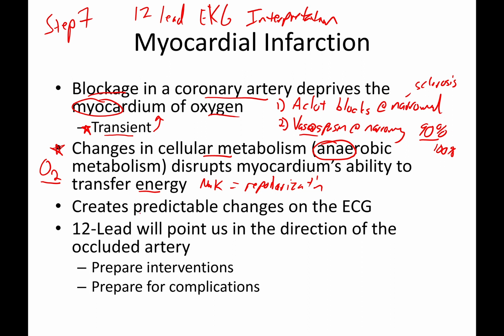Well, they look like predictable changes on the ECG, ST elevation, ST depression, things of that nature. Flipped T waves. What's really, really cool is then if you use a 12 lead, it can actually point us in the right direction for which artery has been occluded. And we'll get into that part next. That's one of the big focuses of this next section.